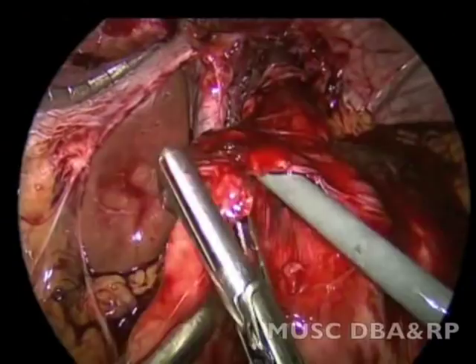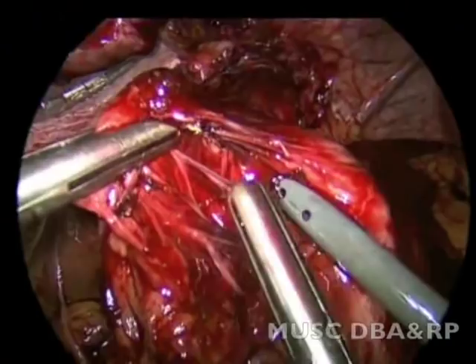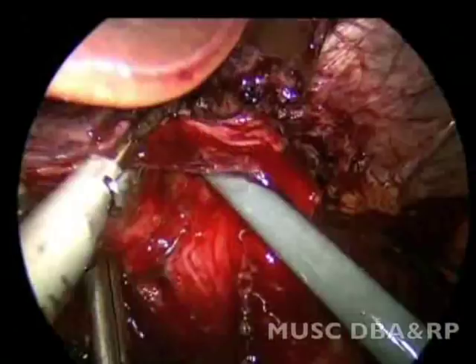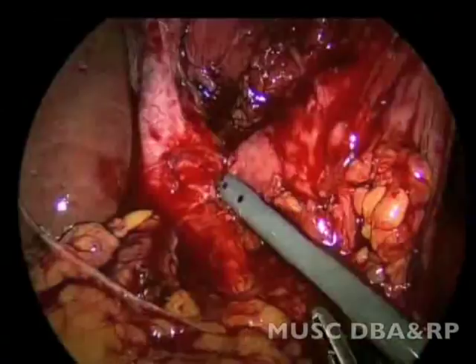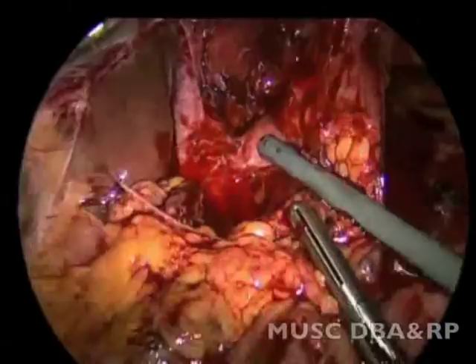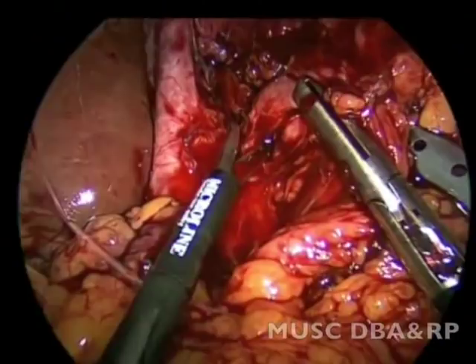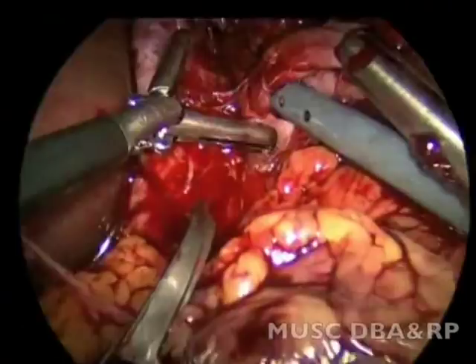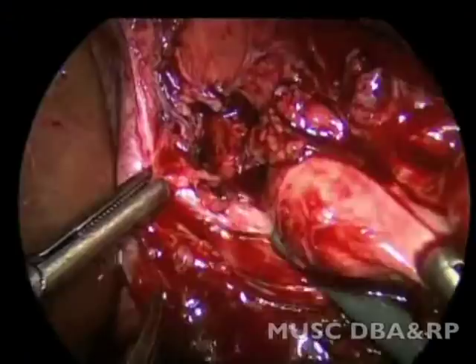The right side of the gastroesophageal junction is freed from the wrap. Posterior adhesions of the wrap to the decussation of the crura are taken down with sharp dissection, taking care not to injure the stomach. The left crus is now visualized from the right side.